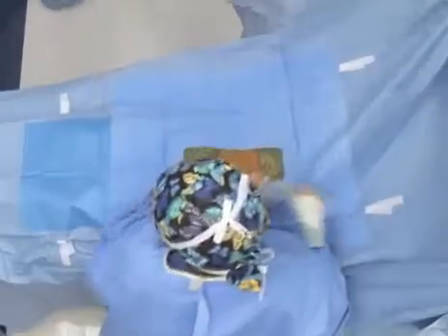The fenestration is centered over the incision site and the drape unfolded over the patient's body. After draping is completed, if any areas of the patient are exposed, the areas will be covered with a plain sheet, which may also be called a half sheet or cover sheet.